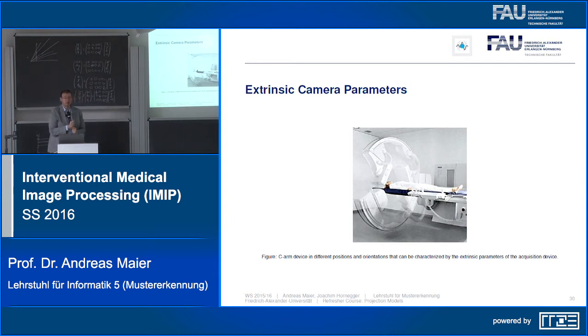Yes, because you have to accelerate. So you don't want to make the detector heavier, because in general you have to hold the entire structure. So what you actually want to do is make both as light as possible, because then you can also save weight on the C. And the reason why it deforms is because they want to save weight. You will make everything heavier, and if everything becomes heavier, it will be more bulky, and it will take much more force to accelerate and decelerate. And if you do a 3D scan, you want to rotate this entire gantry by 200 degrees within 4 seconds, and you have to accelerate everything. And the thing that decides how heavy, or how reliable, the structure has to be is the acceleration and deceleration.